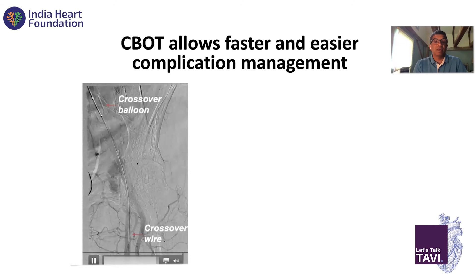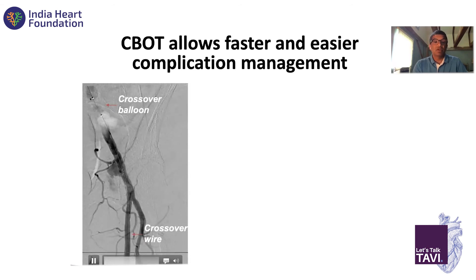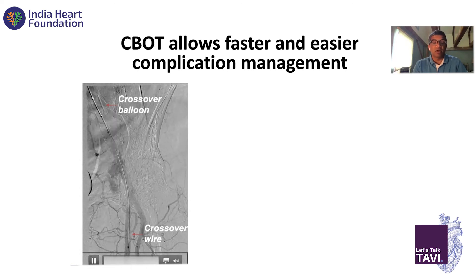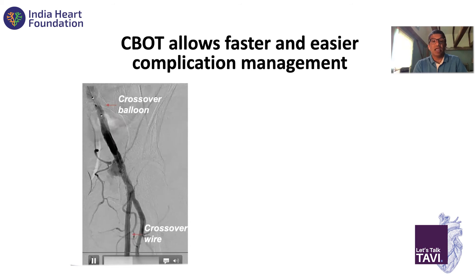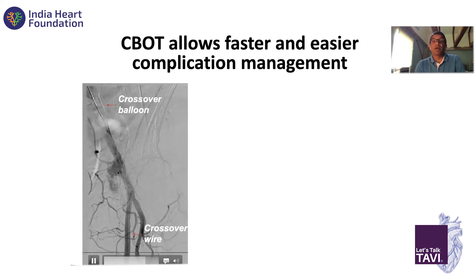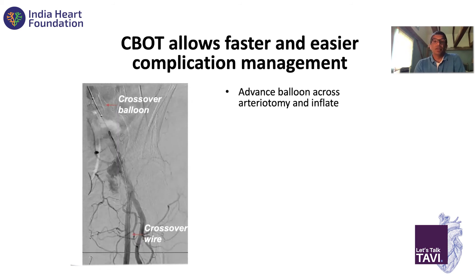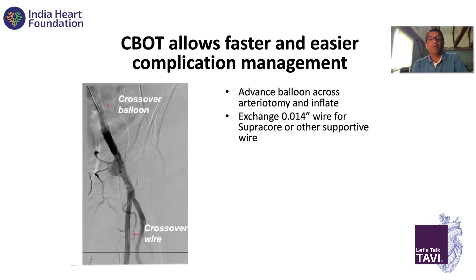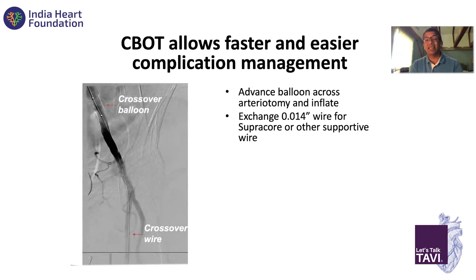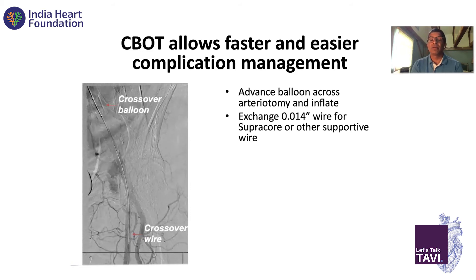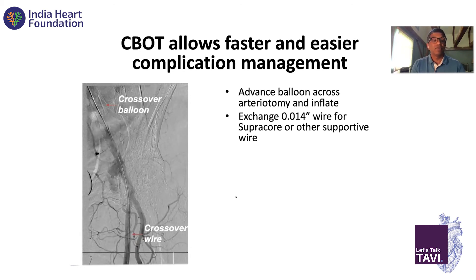Here you see an example of a higher stick — this is the top of the femoral head. The sheath has come out, and this is our crossover wire down into the SFA. We left our balloon here, and angiography is done through the balloon. We didn't see a lot of bleeding, but this is a high stick — all of this is retroperitoneal, so we don't see much bleeding. But if you let this go, it's going to be a pretty big retroperitoneal hematoma. We advance the balloon across the arteriotomy and try balloon tamponade first. If that doesn't work, in a high-risk person I would just stent this to prevent a major retroperitoneal bleed. I inflate the balloon at the site of the arteriotomy for five minutes and if it doesn't look okay, I stent it.